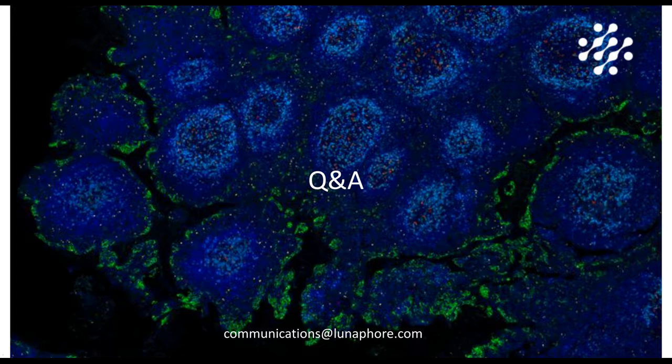For brain, you might want to make sure that first your tissue thickness is compatible with the device, and then that you have a way to control the autofluorescence of your tissue. For that, it's totally feasible to implement an autofluorescence quenching step and add it to the standard multiplexing TSA protocol. It is something that we have tested and that would be feasible here.